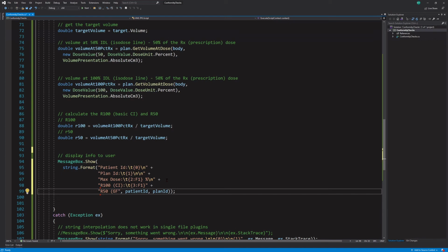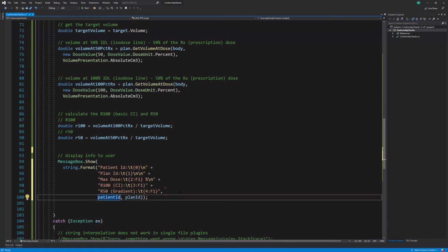And then this measures gradient, right? We may not need to tab or be able to tab this, or maybe we need 2 tabs here. We can fix that in a minute. But all right, so this is going to be 4, and let's do 1 decimal place as well. Okay, so we'll just go ahead and bring these down. So we've got patient ID, plan ID.